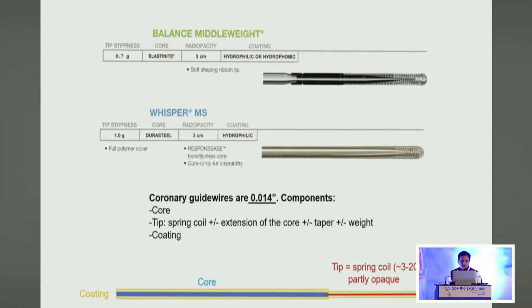And of course, the most important point is the coating. I'll come to the coating, because this is what it is. Sometimes the coating can be from here up to this point, or it may end just before the tip. Okay.